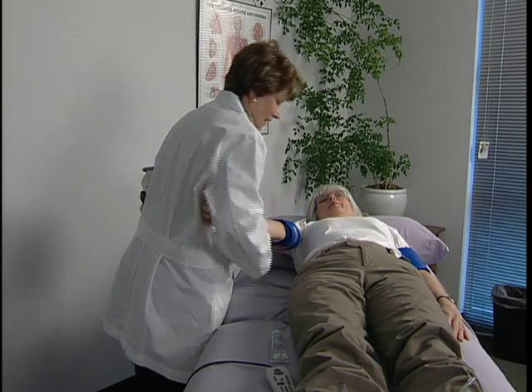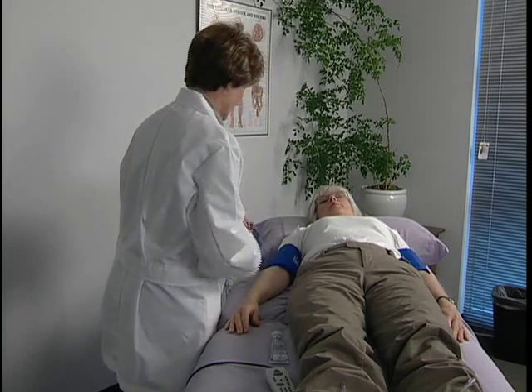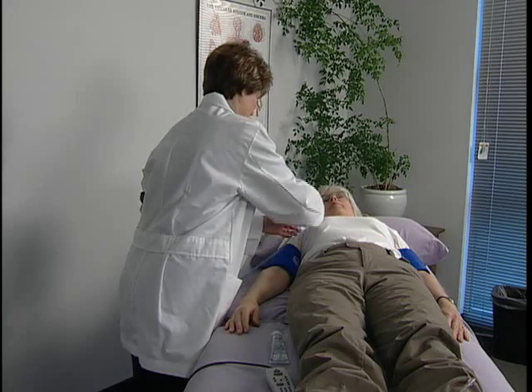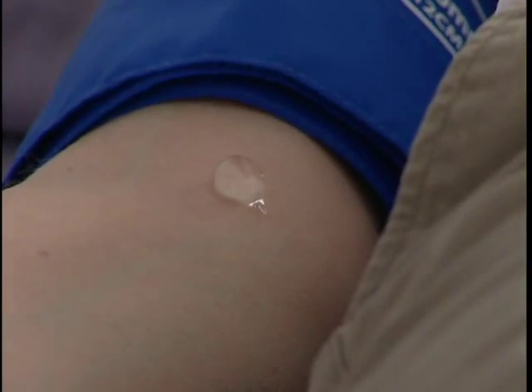Wrap a cuff at each arm and ankle to prepare for the exam. Use the appropriate size cuffs based on the circumference of the limbs. Start at the right brachial artery site and connect the hose to the cuff.